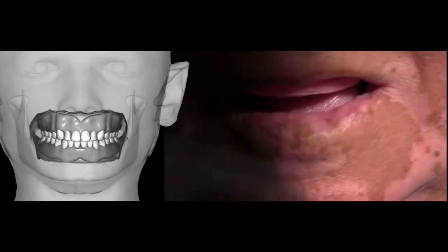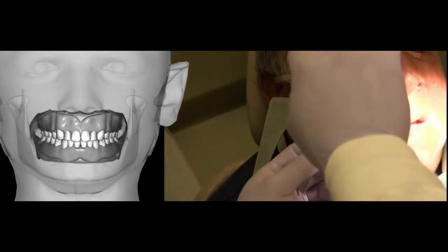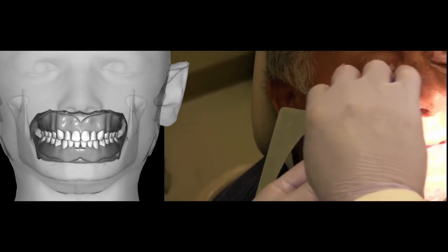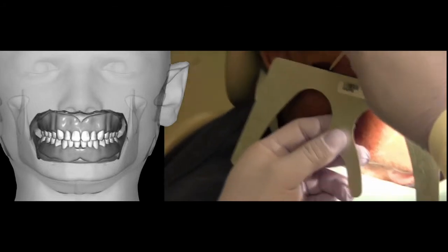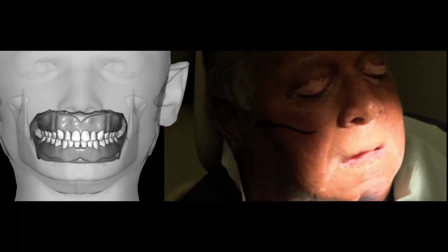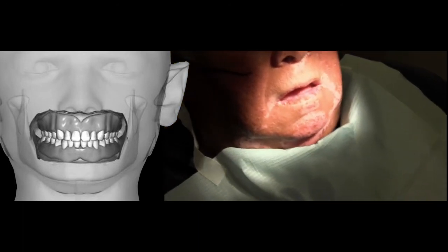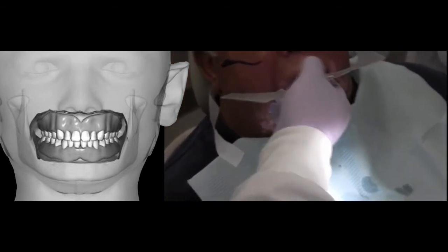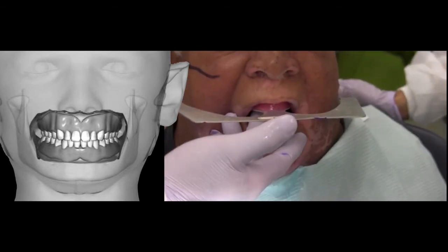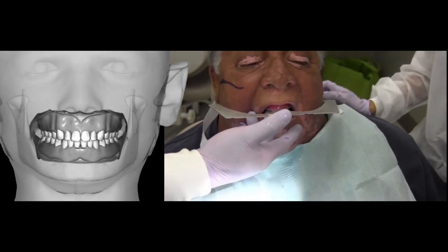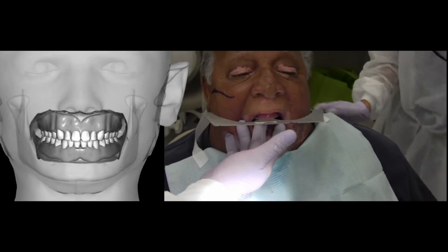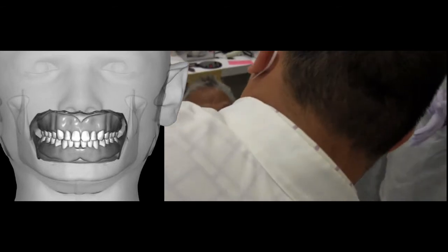So we have the anterior point established. We are now establishing the occlusal plane, conventionally using a wax rim. This is an evaluation of our current occlusal plane in the frontal view, the sagittal view, and the height. You need to three-dimensionally assess the X, Y, and Z axes to determine the correct occlusal plane.